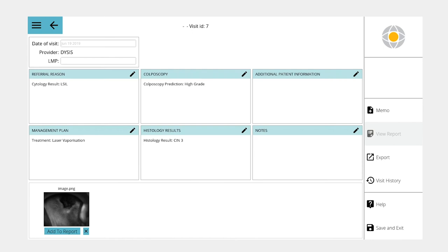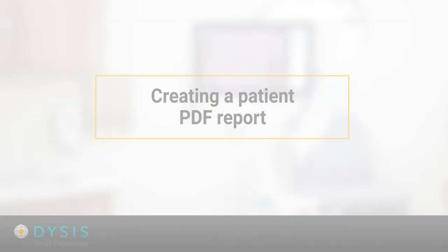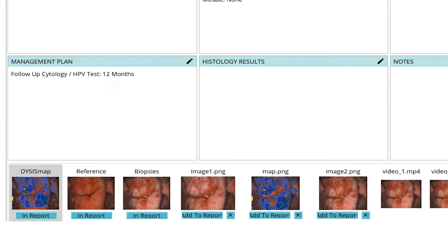Creating a Dysys PDF report. Images which are included in the patient report will be labeled as In Report below the image. To remove any images, select In Report and the image will not be included.